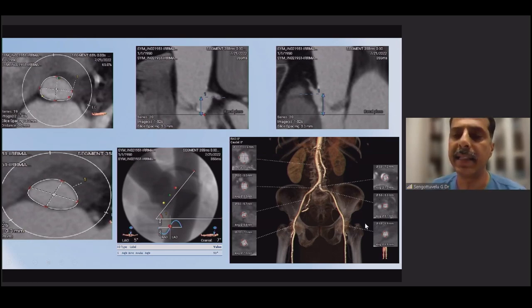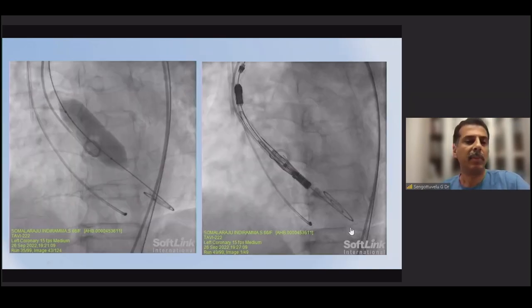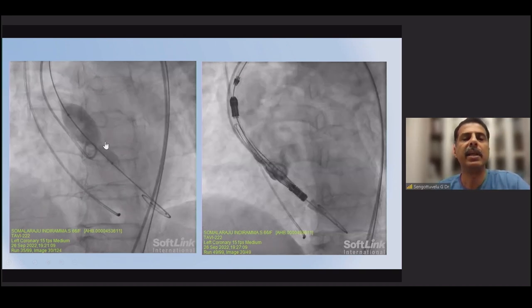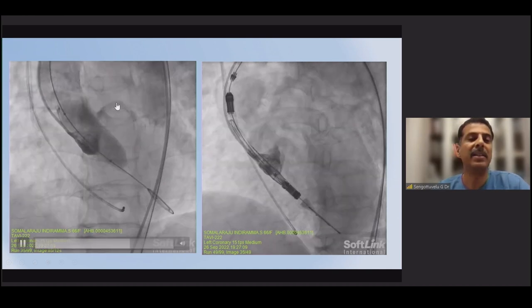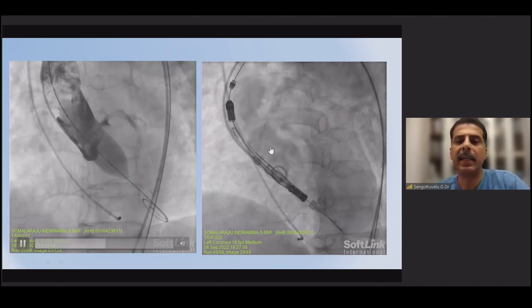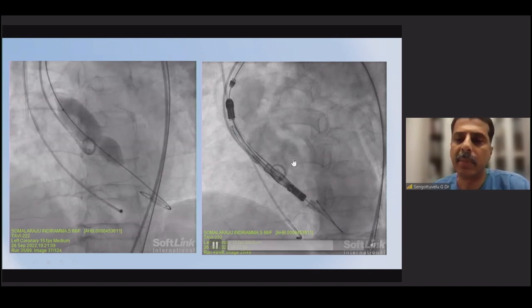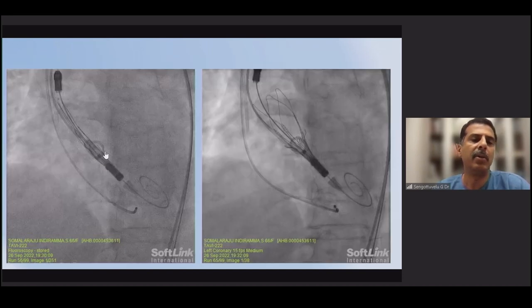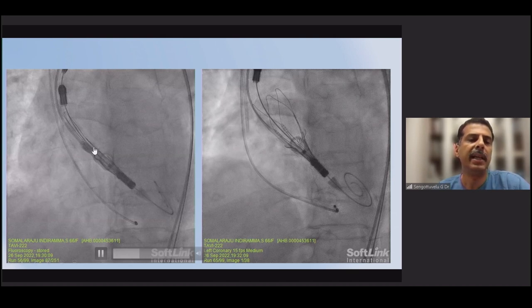The iliofemoral access vessels are favorable, with diameters above 5 mm, compatible with the iSleeve sheath. Predilatation is performed with a 20 mm balloon — no significant calcification in this case, so a slightly larger balloon is acceptable. The balloon is centered and fully inflated. The valve is then positioned with the pigtail in the non-coronary sinus and the delivery catheter marker's lower border at the level of the annulus. Slight rotation is applied to achieve commissural alignment.